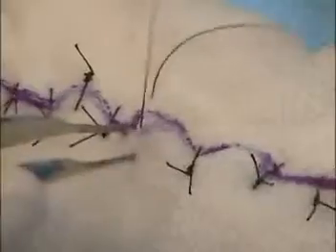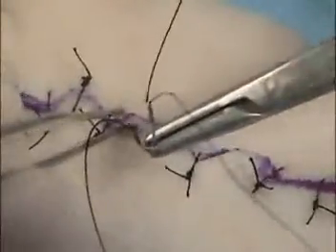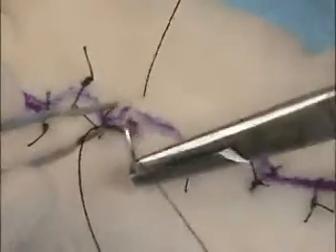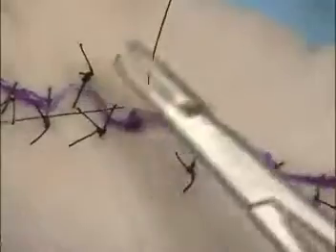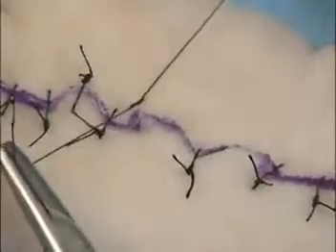There the corner stitch is put into position. It now comes out through the skin on the opposite side so that the closure can be made without interfering with the blood supply to the delicate tip where the incision had been previously placed. So there's an example of a corner stitch.